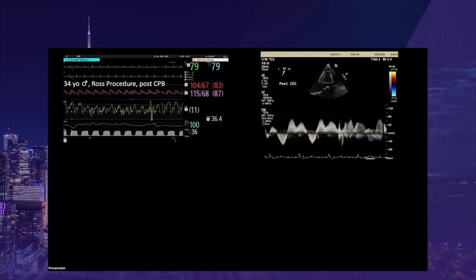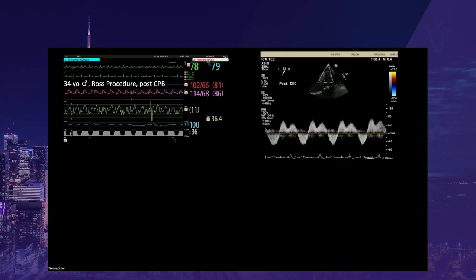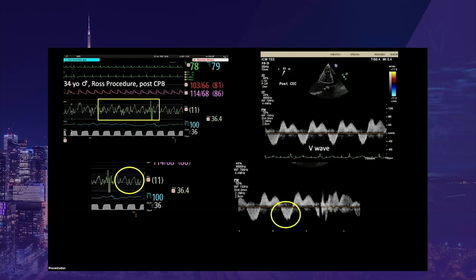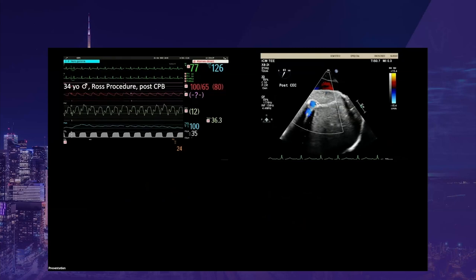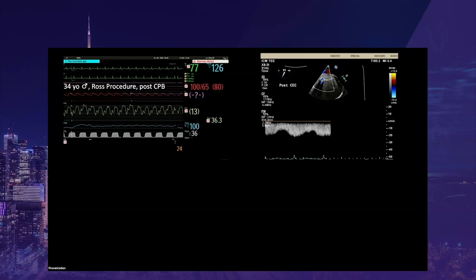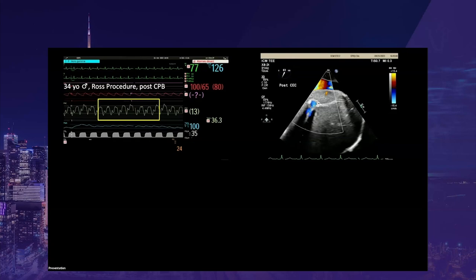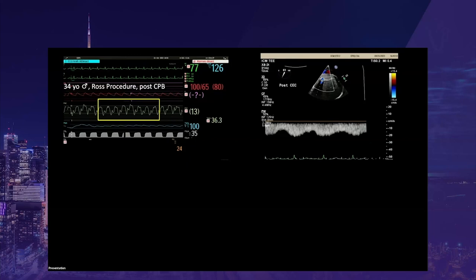Here is a 34-year-old woman post-cardiopulmonary bypass after a Ross procedure. On the top corner, there are giant V-waves on the CVP curve. Those giant V-waves are also seen on the hepatic vein Doppler associated with S-blunting. The portal Doppler shows abnormal pulsatility associated with those giant V-waves. These hemodynamic and echographic findings are compatible with significant RV dysfunction and venous congestion and should be addressed.